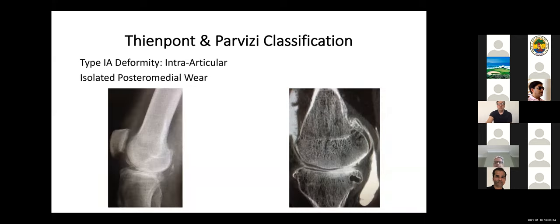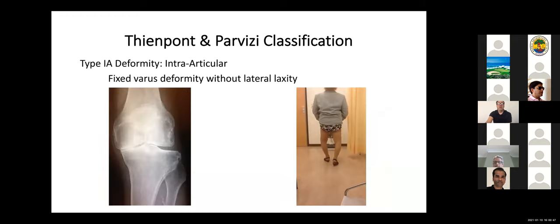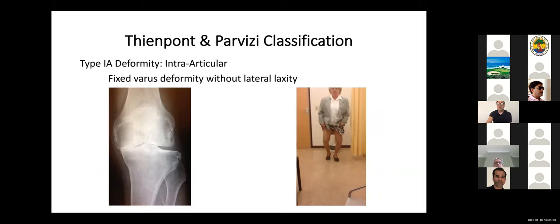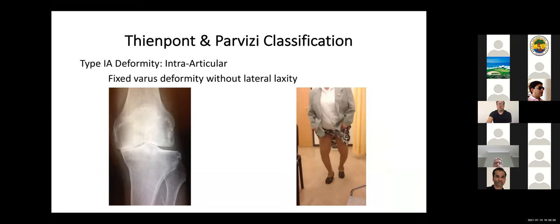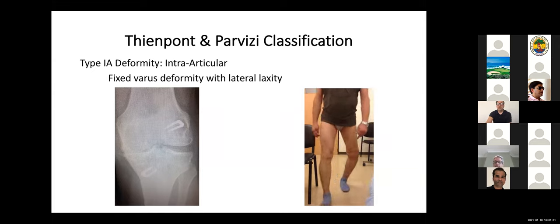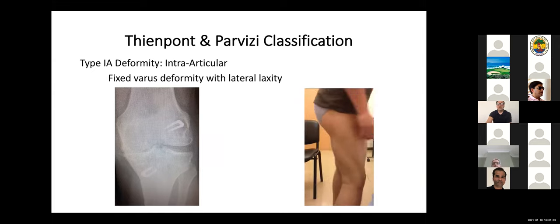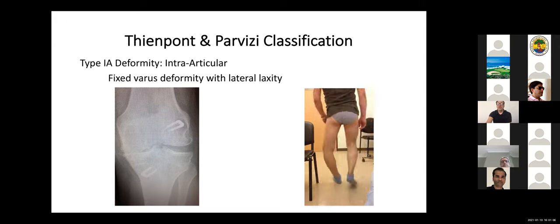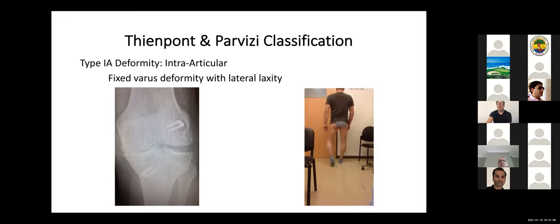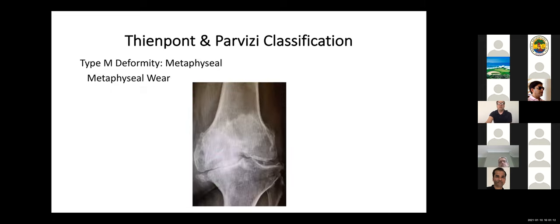This is a posteromedial wear. This is in case where you lost the ACL, you can see that there is a shift posteriorly, and you can see on the ArthroCT that the wear in this case is posterior and no longer anteromedial. Then we had fixed varus deformity without any lateral laxity. You see that this lady, when she's walking, she has a varus knee, but no specific varus thrust. And finally, you have this case where you can see that there is lateral laxity in a fixed varus deformity knee. So this was all the types of intra-articular deformity.